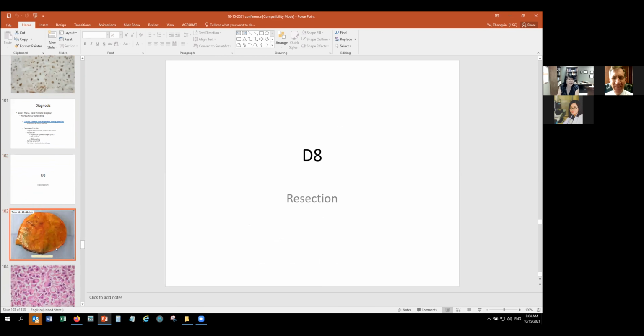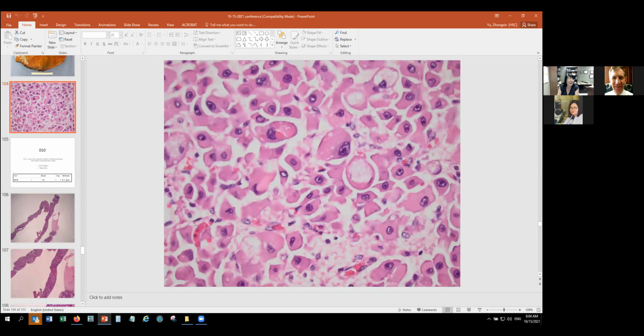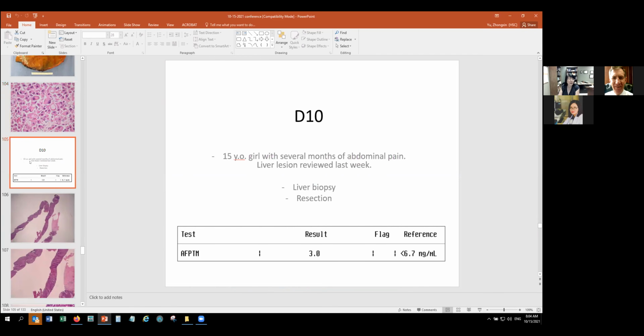The same patient got a resection later on. So that's what this slide was taken from. Large tumor cells, and this is residual hepatocyte, so big ones. And in the resection slide you still have some hyaline bodies, some pale bodies, in this kind of case.